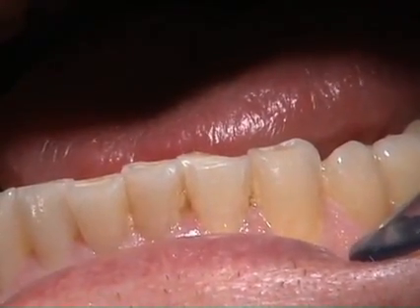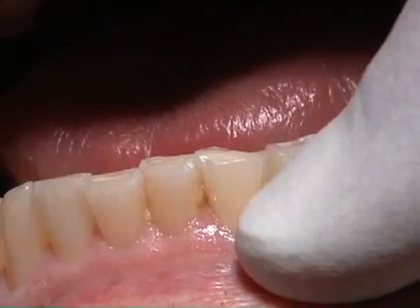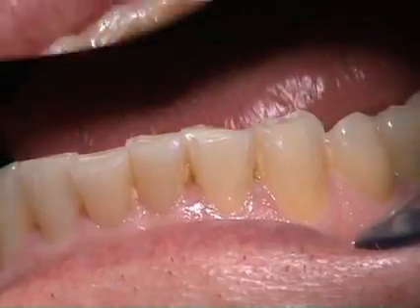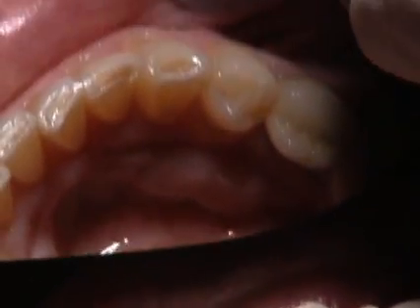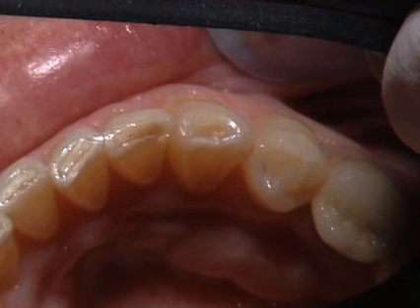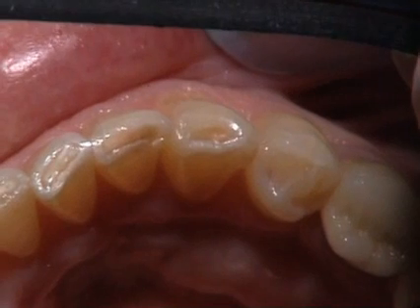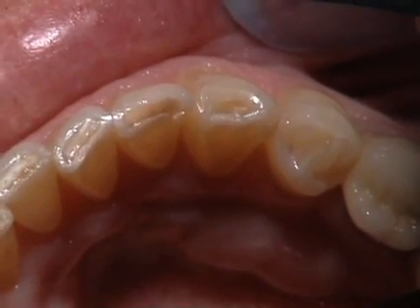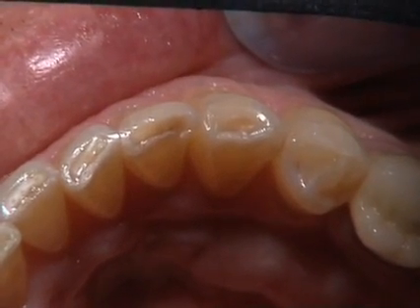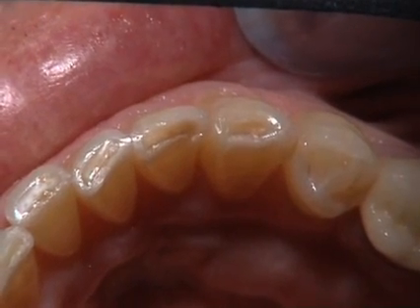The Venus system comes in a two-shaded tab style. Looking at these teeth, the shade tab shows that they are about an A3.5. But if you look occlusally at the incisal tip area, you'll see there's a darker dentin shade and a lighter enamel shade. So as we build these teeth, we're not just going to pick A3.5 — we're going to build a more opaque, darker dentin shade, and then add a lighter incisal or enamel shade, where the two combined end up becoming the A3.5 shade.